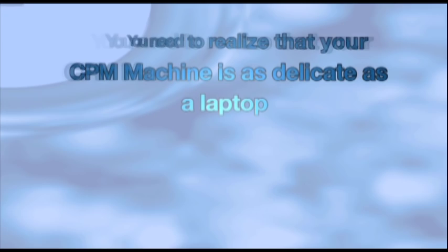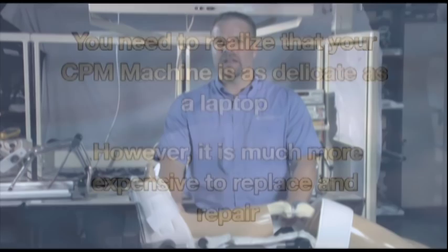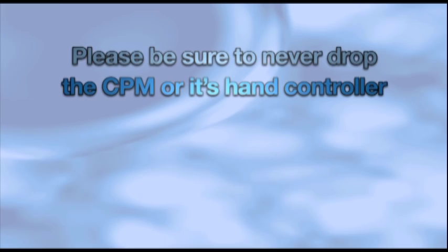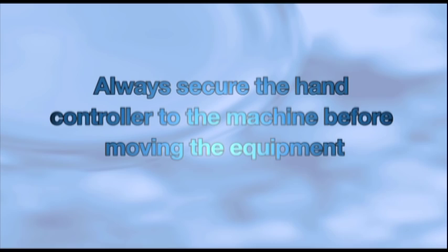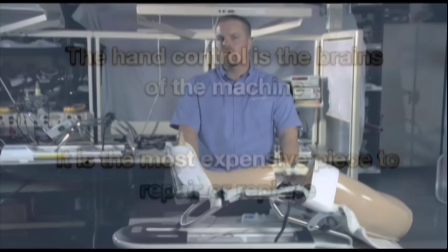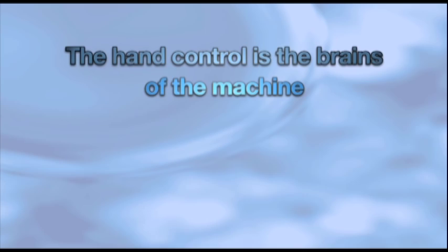Okay, so you need to realize that your CPM machine is as delicate as your laptop computer. It is, however, much more expensive to replace and or repair. It is crucial that you take good care of your CPM to keep it out of the repair shop and running for years to come. A properly cared for CPM machine can often last well beyond five years. Please be sure to never drop the CPM or its hand controller. Doing so may cause permanent failure. Always secure the expensive hand controller to the machine before moving the equipment. The hand controller is the brains of the machine and is the most expensive piece to repair or replace.